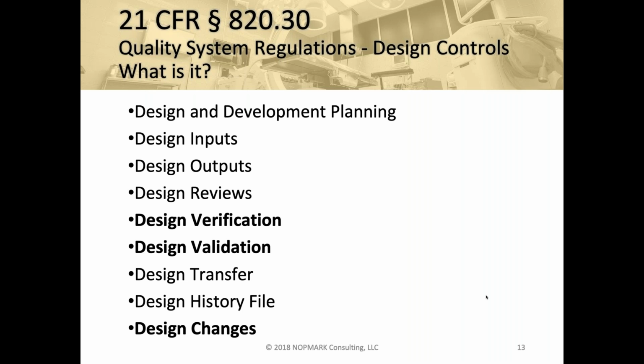And that's where validation ties in. The transfer, software testers will normally not play a big role in transfer. This is typically, okay, our R&D is done, the software is done, it's verified, it's validated. I'm now doing that transfer to manufacturing or production so they can make the software or distribute it to the customer.